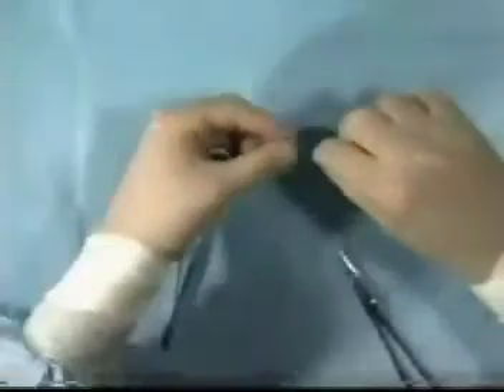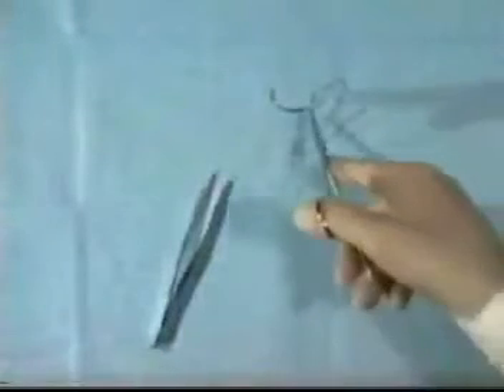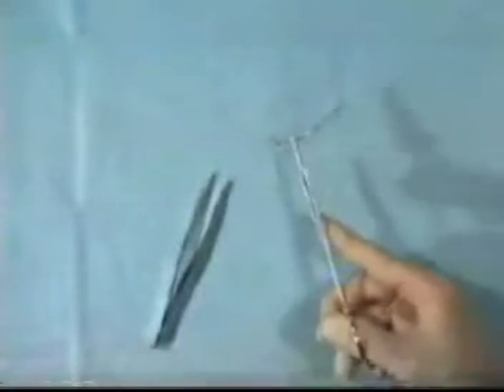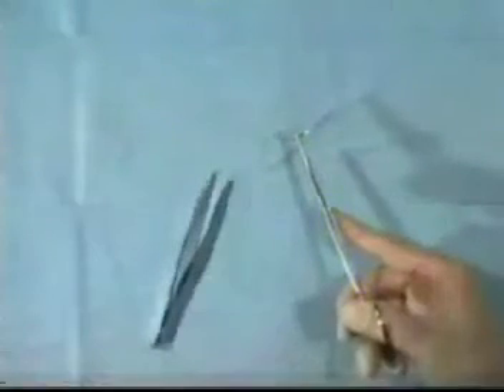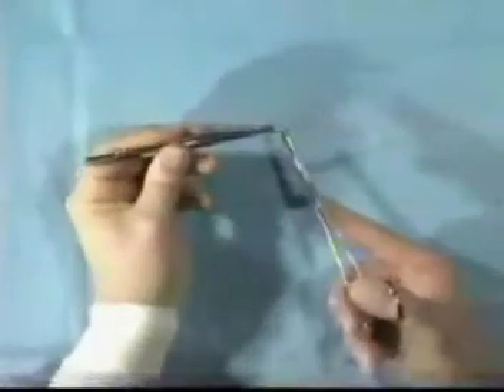It is important not to handle sharps directly. When picking up needles, use the needle holder. If you wish to alter the position of the needle in the needle holder, don't use your fingers — use the forceps to hold the needle and reposition it.